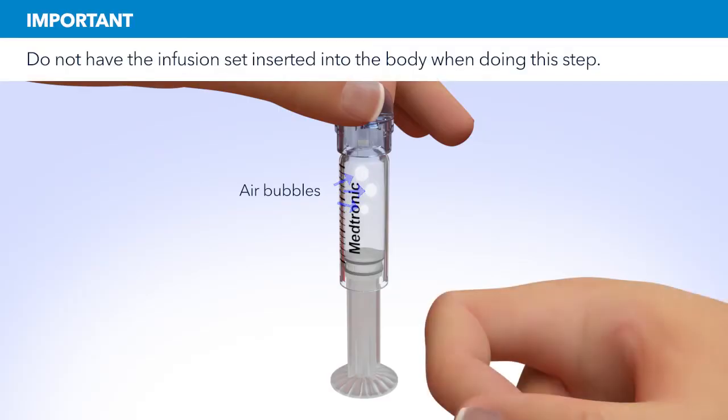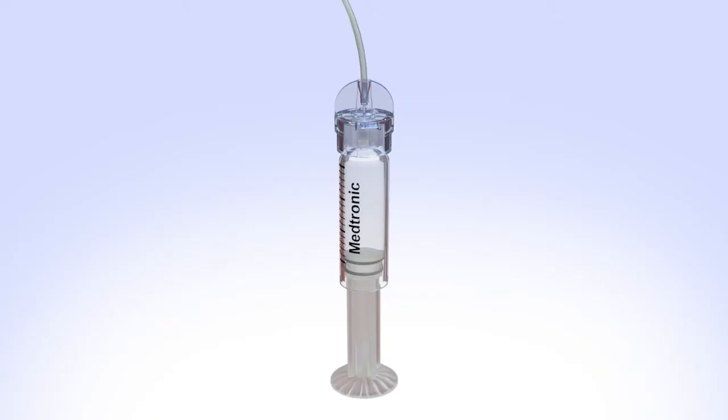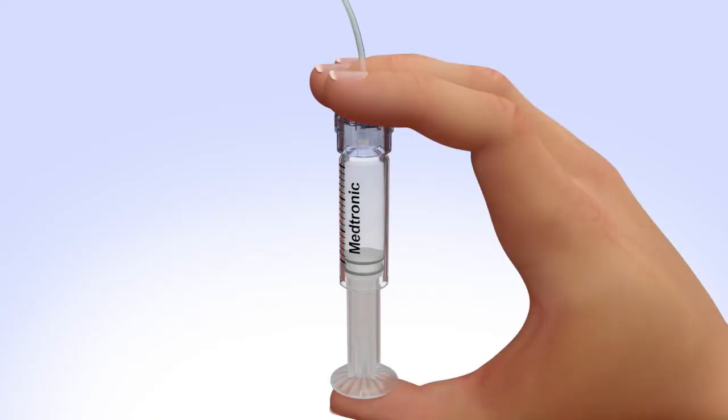Tap the reservoir to make any air bubbles rise to the top. Purge the air bubbles that have risen to the top by slowly pushing up on the plunger until all of the air bubbles have been pushed out of the reservoir and you see a small amount of insulin in the tubing. If you're not able to push insulin into the tubing, disconnect the tubing connector and then reconnect it.